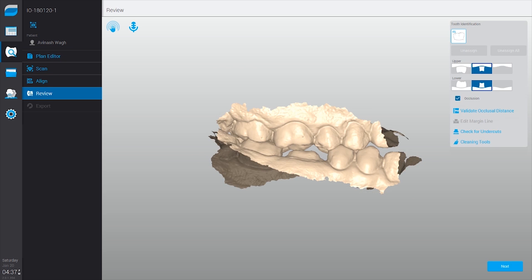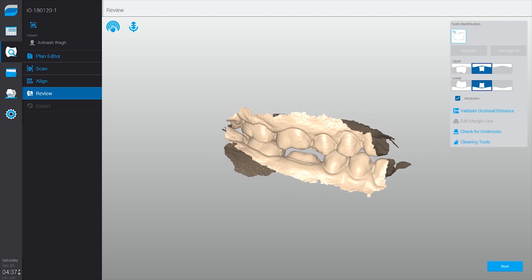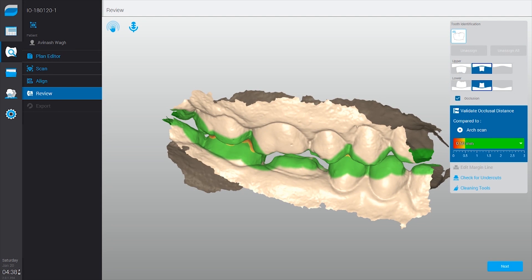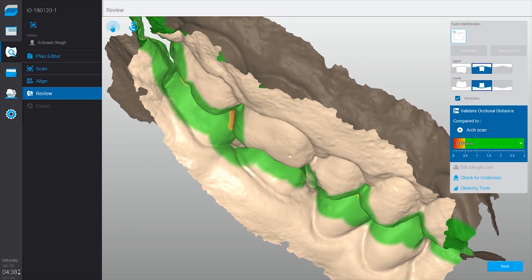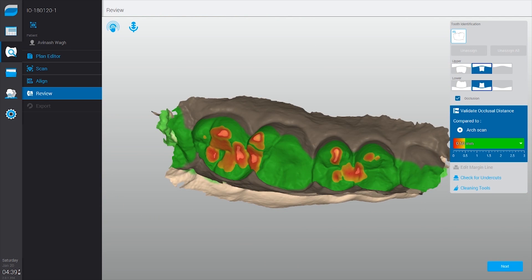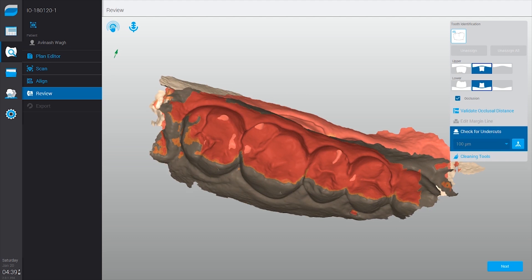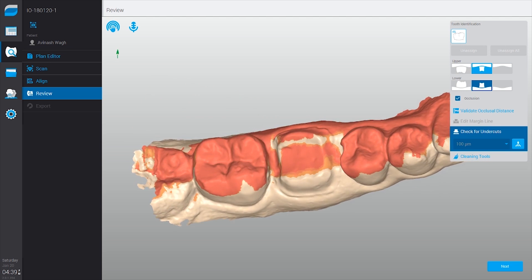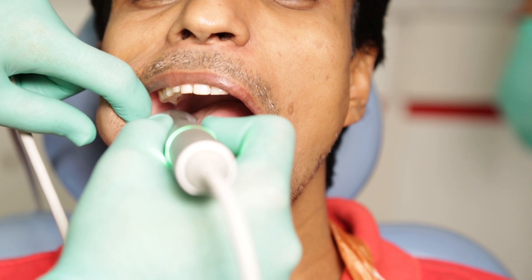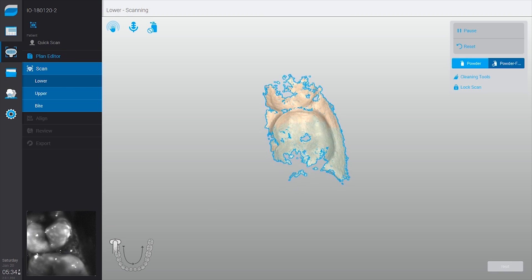You also have this unique feature of gauging the occlusal reduction in the form of a color-coded map. As long as you can see green, you are okay as far as the occlusal clearance is concerned, whereas red will indicate that you need some amount of reduction. I can also see the path of insertion in case I'm working on a bridge or multiple units, giving me the ability to adjust the path of insertion then and there instead of calling my patient back. I can also use the Dental Wings intraoral scanner to make full arch scans.